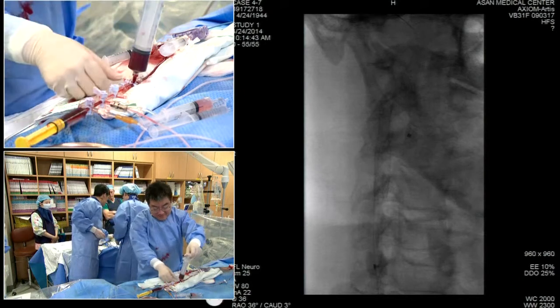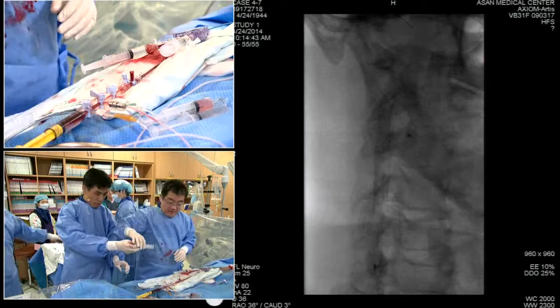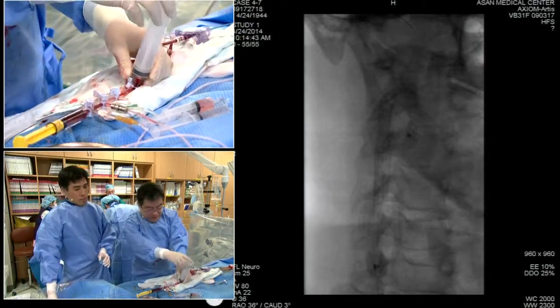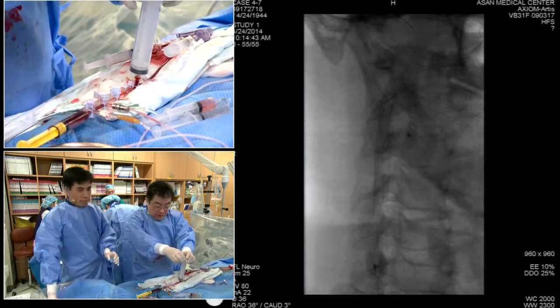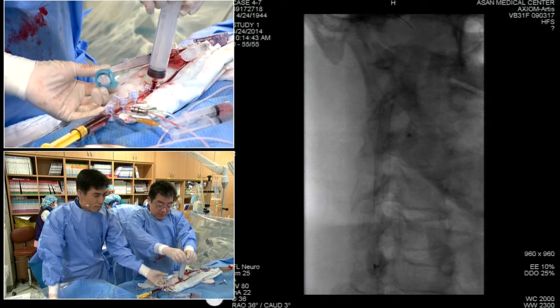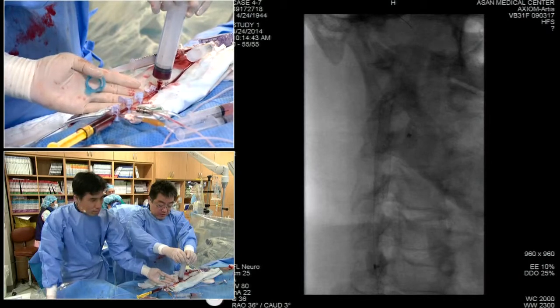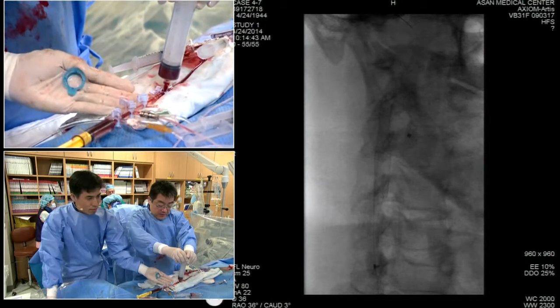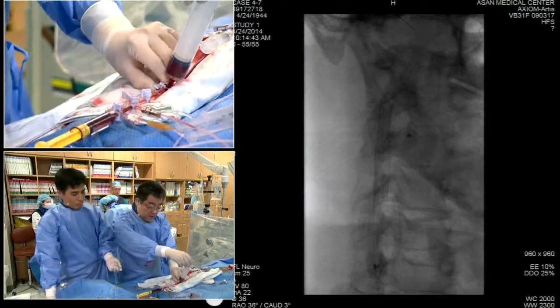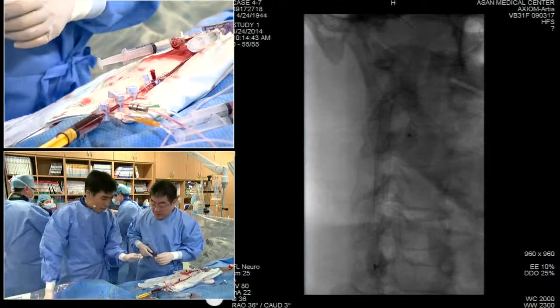Dr. Gao, what percentage of your patients are intolerant to proximal protection in general? No, I think, well, it's about 10-15%. But by intolerance, sometimes if you can keep your ischemic time very short, even though the patient starts to yawn or become drowsy or dizzy, as long as you can get the job done quickly and release the clamping, the patient will come back. So the true intolerance, I mean, you had to stop the clamping.